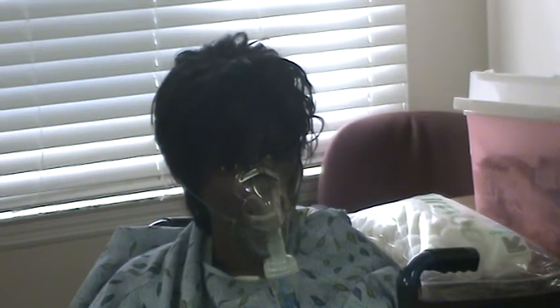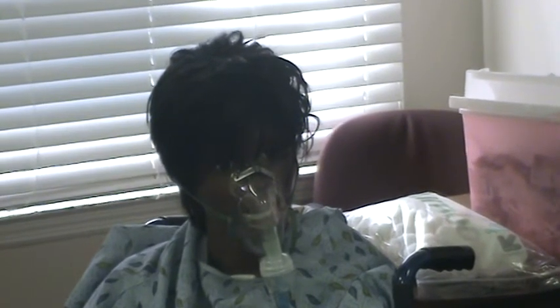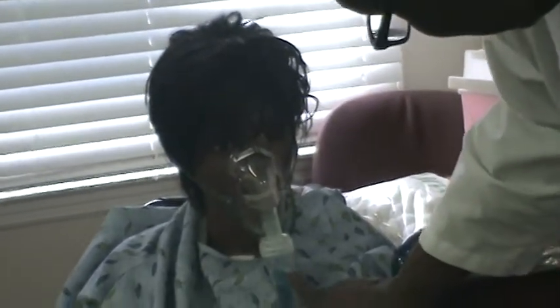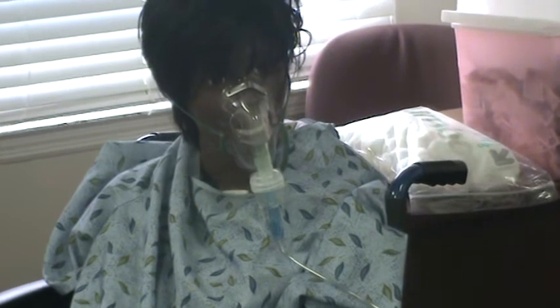So that's nebulizer treatment. It's not hard. You just need the machine, plug it, connect the tubing, put the medicine, turn it on. That will run for about 10-15 minutes until it's finished. So you'll be checking, and when it's empty there, then it's time to turn it off.